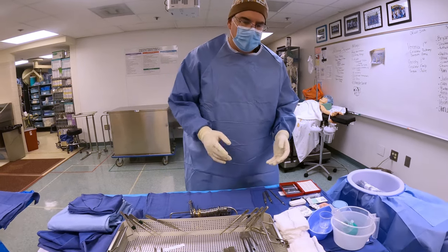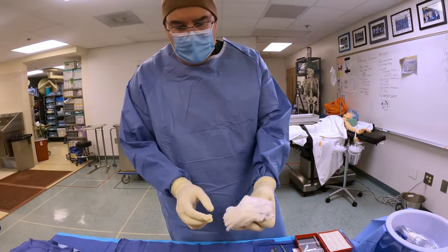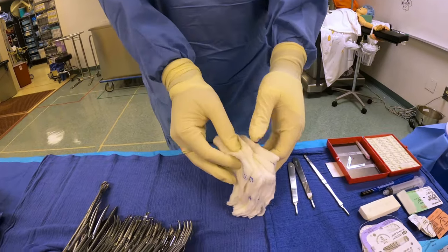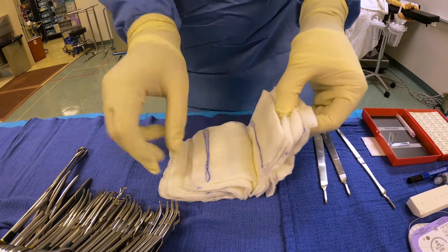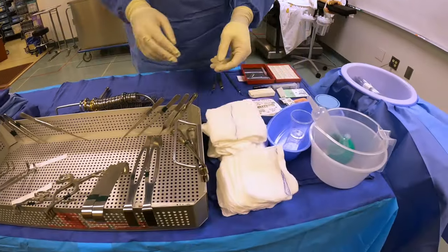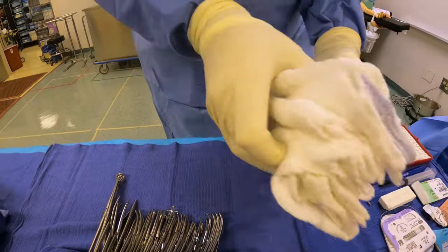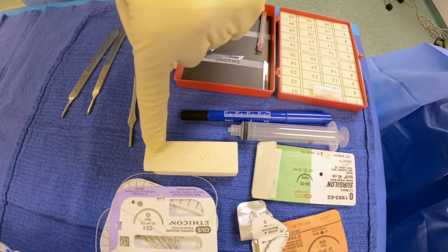Now I'm ready to start my count. First thing you count is your sponges, and always the first sponge you count is your Raytex. With my Raytex — see how there's lots of little edges here? I don't like those. I like to count this side; this side has one fold for every Raytex. I'm going to set them right here and grab them one at a time: one, two, three, four, five, six, seven, eight, nine, ten. I'm going to do the same thing with my laps, watching that these tails don't go over the edge: one, two, three, four, five. Do I have any other sponges? Indeed I do — I have my kitners: one, two, three, four, five. That's all my sponges.